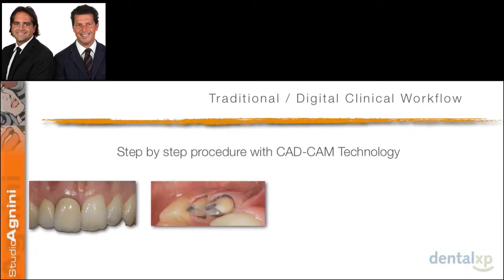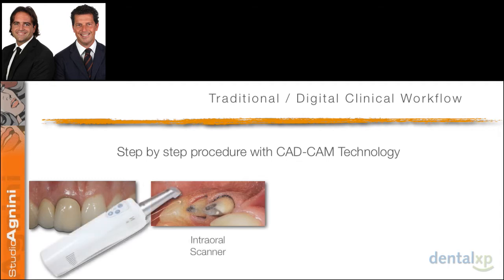And we will see today how the step-by-step procedure with the CAD technology can also change our workflow, can also change our clinical lives. So the clinician can, for example, in a case like this, it's a simple case in maximum intercuspation, arriving at the day of the final impression, and thanks to the intraoral scanner, we can scan the patient's mouth, and from here we can send the files to the lab.